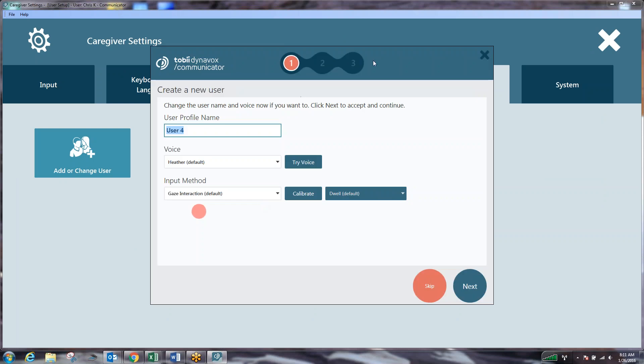When you get to a page that looks very similar to this you will see the user profile name, the voice selection, and the input method. This screen, this small box here will actually take up your entire screen on the device. So what we need to do at this point is type in the user's name. I'm just going to call myself Tom for today.